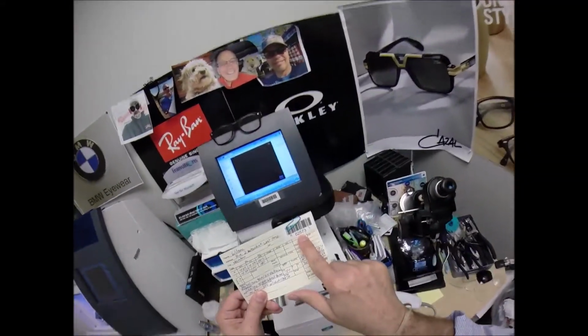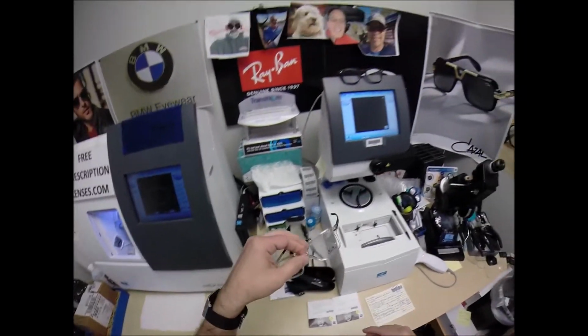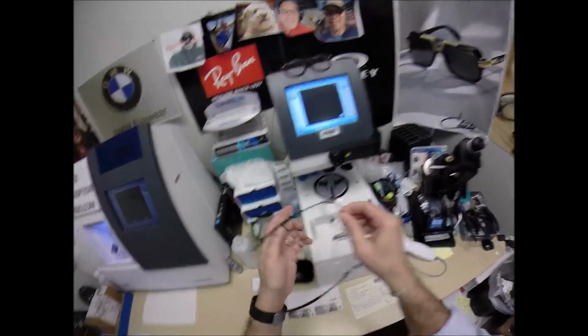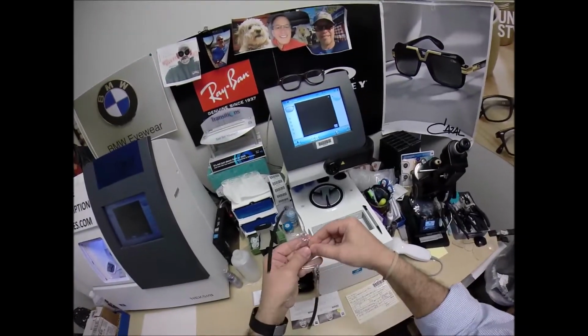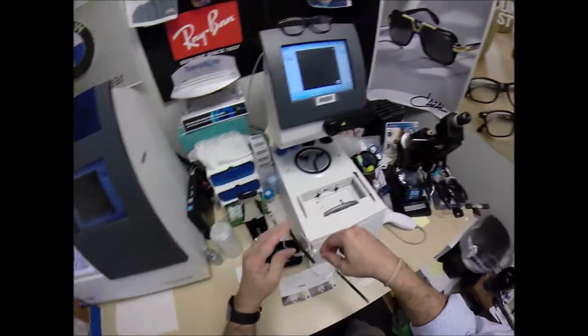So I programmed this shape into the computer. You were Secret Agent 2573. The reason why I did that is years from now, should you ever need new lenses for this frame, I can mail them right to your home and you'll see how to put them in. This is how you take the lenses out: pull up on the top of the frame, push outward on the lens, it pops right out.